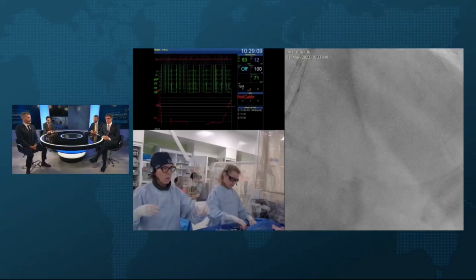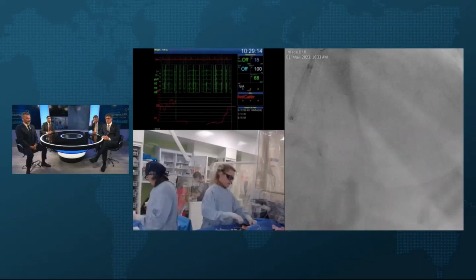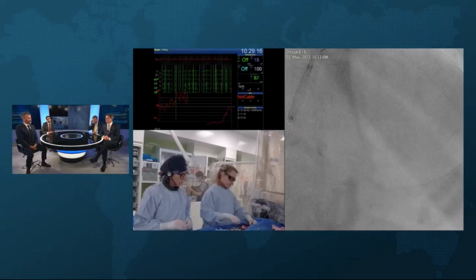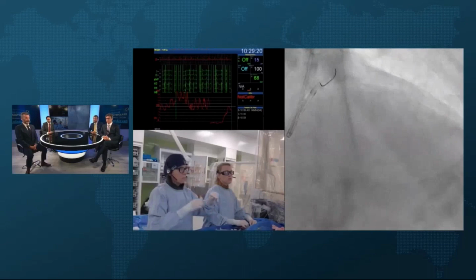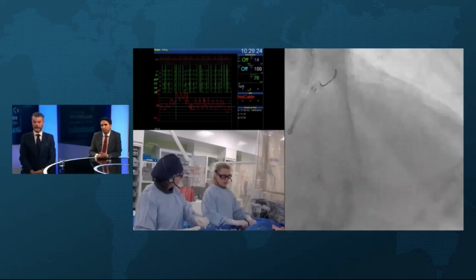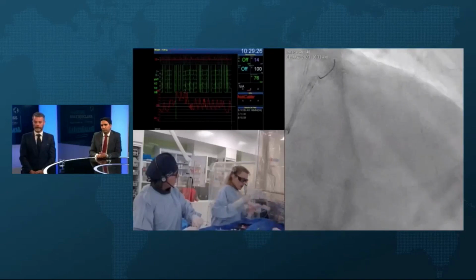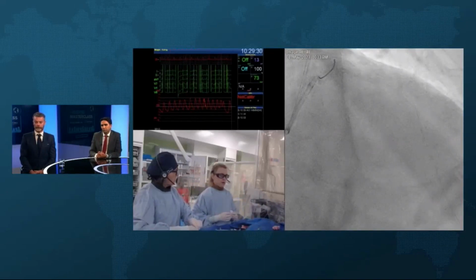as opposed to really having to work it down. That's going to give you more of a, gosh, I wonder if I do need to do some atherectomy upfront, but it looked like it zipped down a bit okay. I thought it struggled a wee bit at the second lesion. I don't know what you thought, Claudia. Was it easy to get across with that microcatheter? Yeah, no, it passed quite easily actually. I mean, there was a bit of resistance.